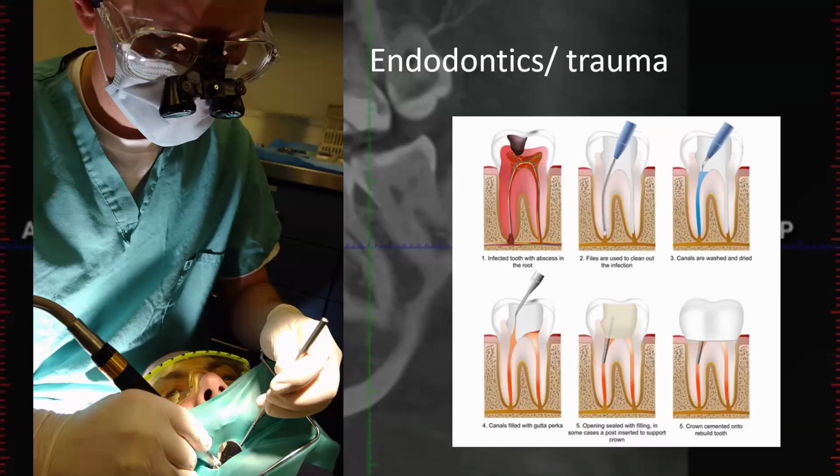All right, let's talk a little bit about endodontics. I would say most endodontists now use CBCT, and usually they'll have a small volume where they can really limit that volume to just a few teeth, and they can get as high a resolution as possible from a CBCT. So there are different types of cone beam CTs out there, depending on your use. Most general dentists might want something that does a fairly large field of view. So the one we have here on the first floor, it's an iCat. It does a medium field of view.